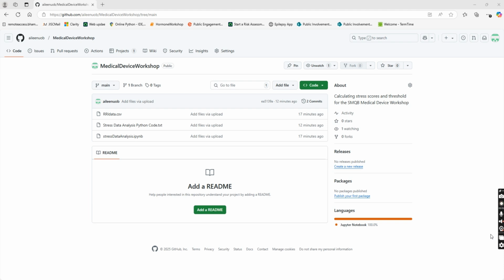So it is a Python script and it's all written completely, so the students don't actually have to change anything within it. There is a task where they can edit some numbers so the graphs can show differently. That's the only thing they have to do, so there's no actual coding involved in this. Again, if you want to challenge the students, you are free to take some sections out.